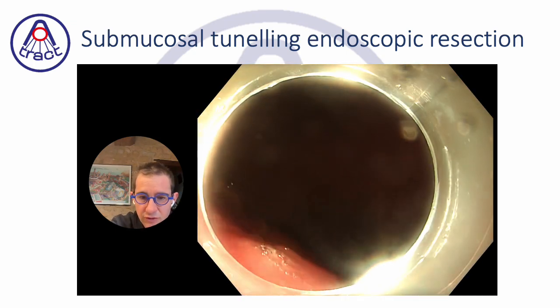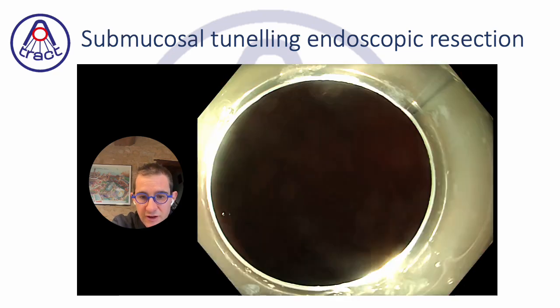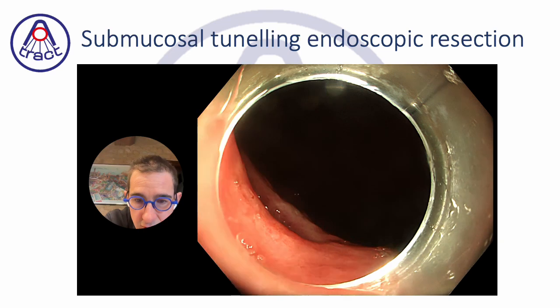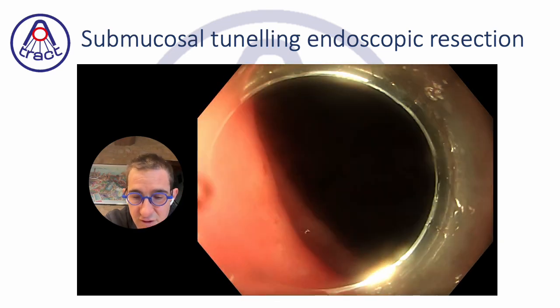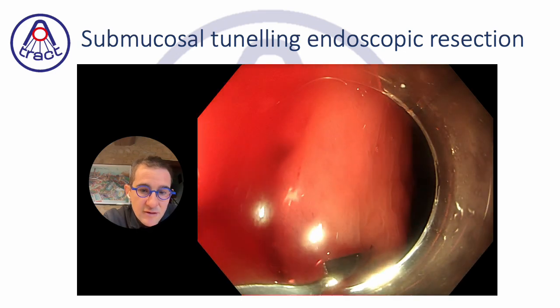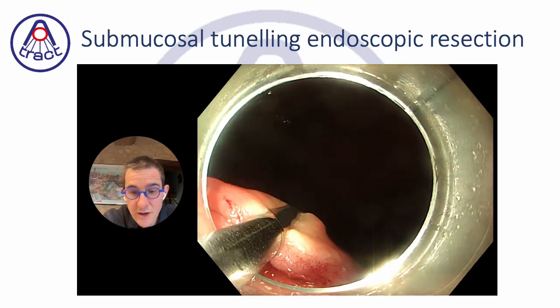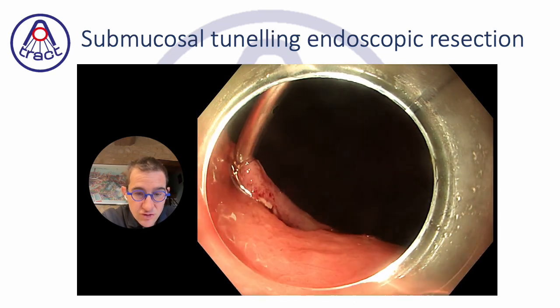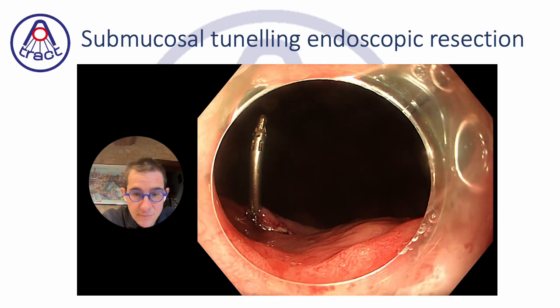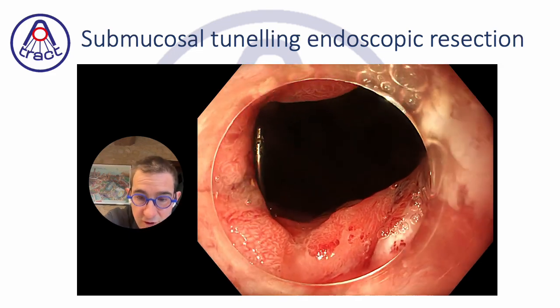Here it's a stricture. The patient has also, as we just did before, a radial incision of the peptic stricture. It was the main problem of the patient, and the stromal tumor was discovered by one of our fellows, Raphael, during a procedure to control the esophagitis. So it was really a chance discovery of this stromal tumor, because of a good examination of the stomach, while the main question was the esophagitis and the stricture. So even if usually it's not the best way to close to use this axis, here it was relatively good and feasible, and you will see that the three clips will obtain a complete closure.